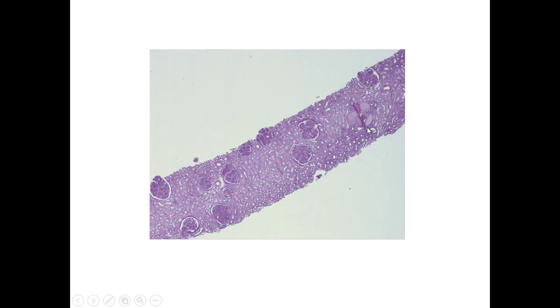So from the low power, I know that this specimen is sufficient. I have 9 glomeruli. I have 1 sclerosed glomerulus, which is maybe a normal finding in old age. So I know from the first look that I have only 1 globally sclerosed glomerulus. This is a global sclerosis.